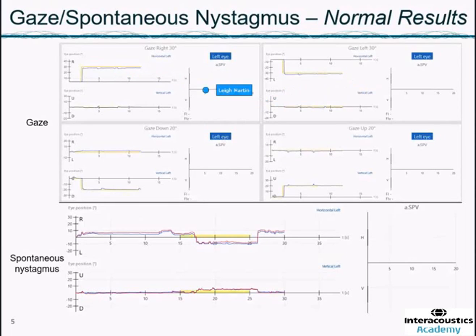These are really not significant. It's mostly just eye blinks and things like that. If it's nystagmus, you'll see it hopefully clearly and repeatably. And then you can see that, again, in gaze up and gaze down, the patient doesn't have any significant nystagmus. Now, as a part of the spontaneous nystagmus, you usually do the gaze at center gaze, and then you see the effect of fixation.